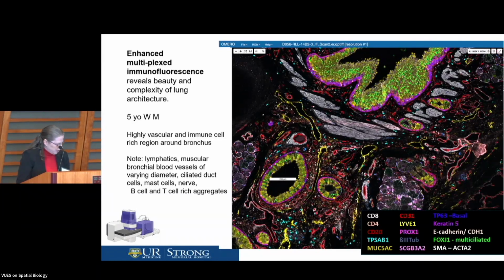Below that, you see bundles of smooth muscle, and there would be supportive collagen and other molecules of extracellular matrix. And embedded in the ECM, we have many structures and cells. The round structures that you see in the lower left are actually submucosal gland ducts that end in submucosal glands that are producing mucus and self-defense molecules. Immune cells tend to hang out there as well. And there's also a mixture of epithelial cell types in those glands.